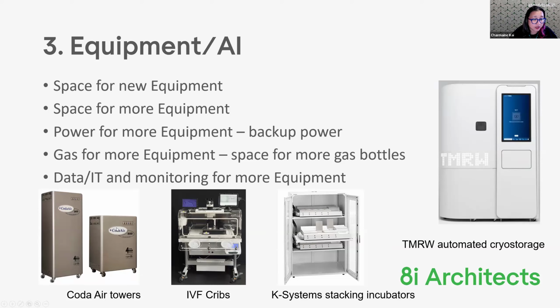And then you've got Coda air towers, obviously different sizes, and you can put them around the lab as a supplement for the air handling that's required. And it might be that you need extra if you're off-gassing something, or if there's some external factors such as bushfires or something like that, that you need extra Coda towers.